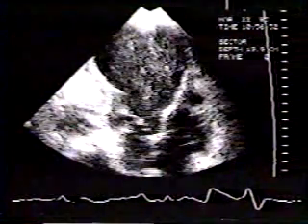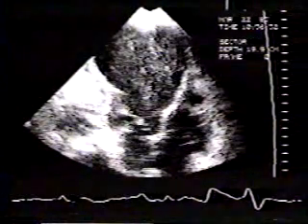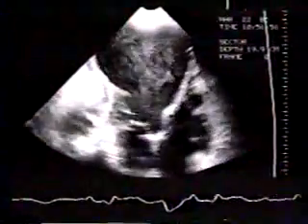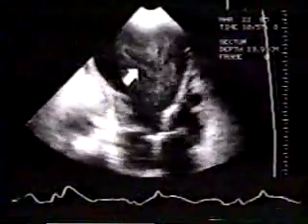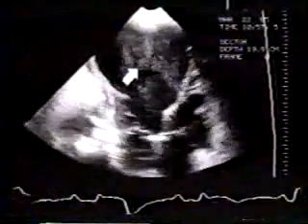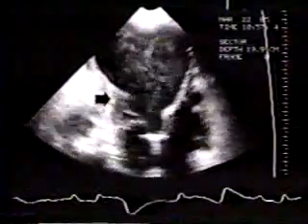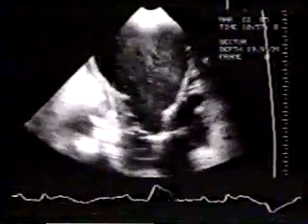This patient survived a massive anteroseptal apical infarction and has developed a huge apical aneurysm. His ejection fraction was calculated as less than 10%. Note this spontaneous, swirling pattern within the left ventricle, which can be seen in severe low-output states. Because of the normally contracting basal and mid-level inferior and lateral walls, he underwent successful aneurysmectomy.